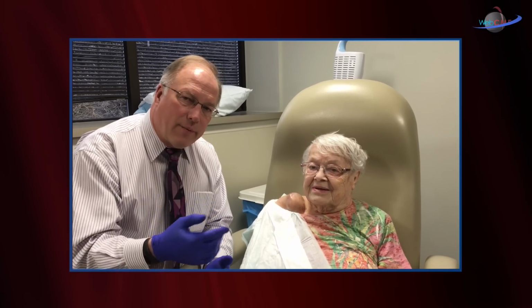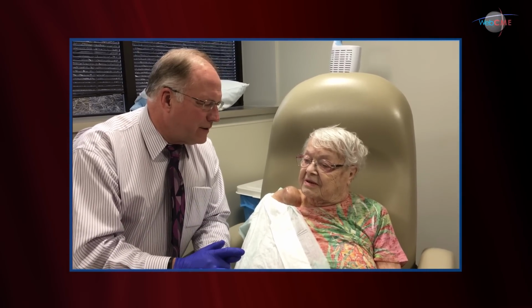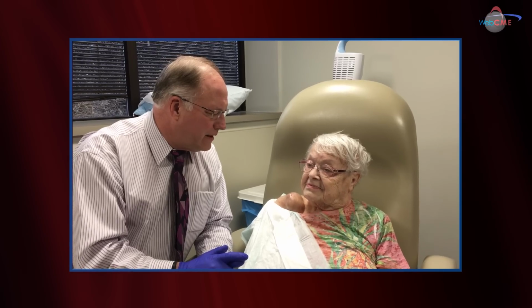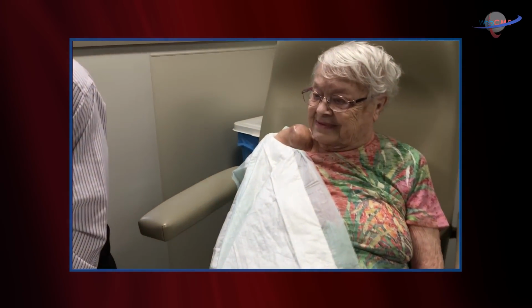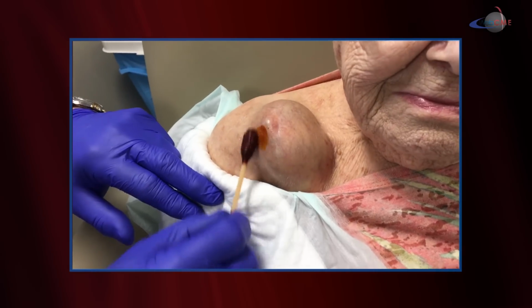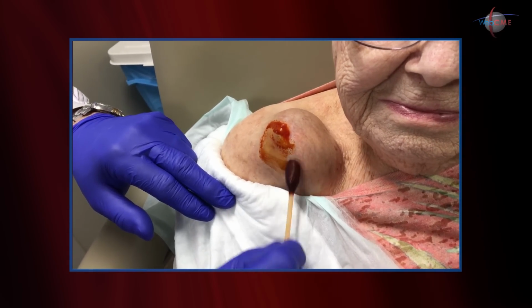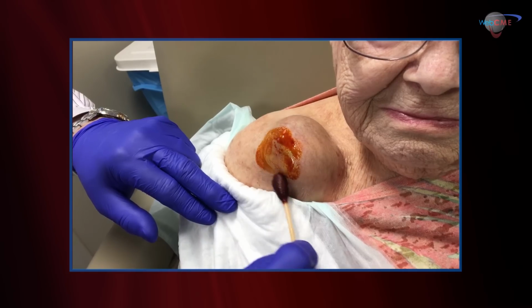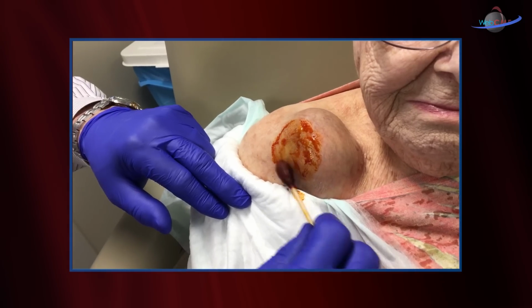You know, you could always think about putting some sort of pigtail catheter into this or some sort of drainage device, but then we get an indwelling foreign body, and that would potentially cause you an infection. I certainly don't want to do that. So you ready to do this? I'm ready. All right. So the first thing we're going to do is do a little prep. I already sort of know where I'm going to go because, like I said, I did this just about a week ago. We don't need to sterilize the entire area, but I am going to prep the area that we're going to be entering.